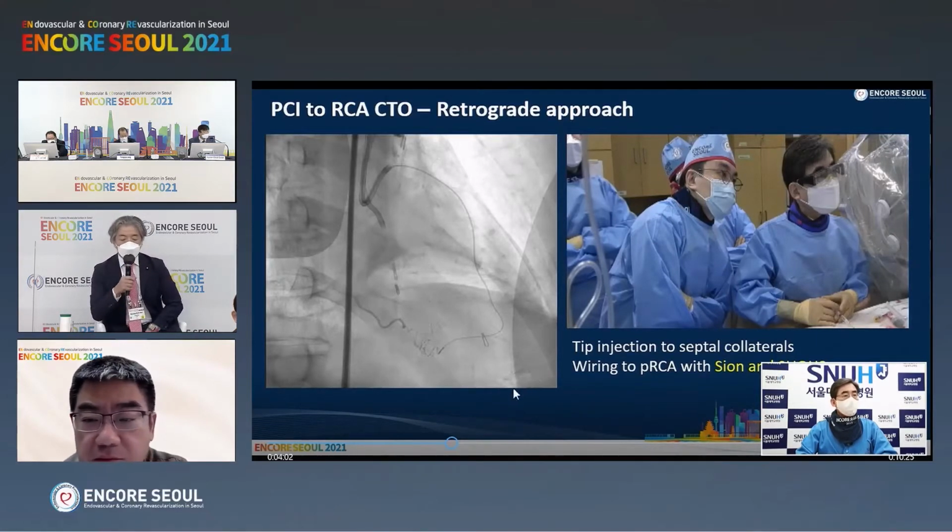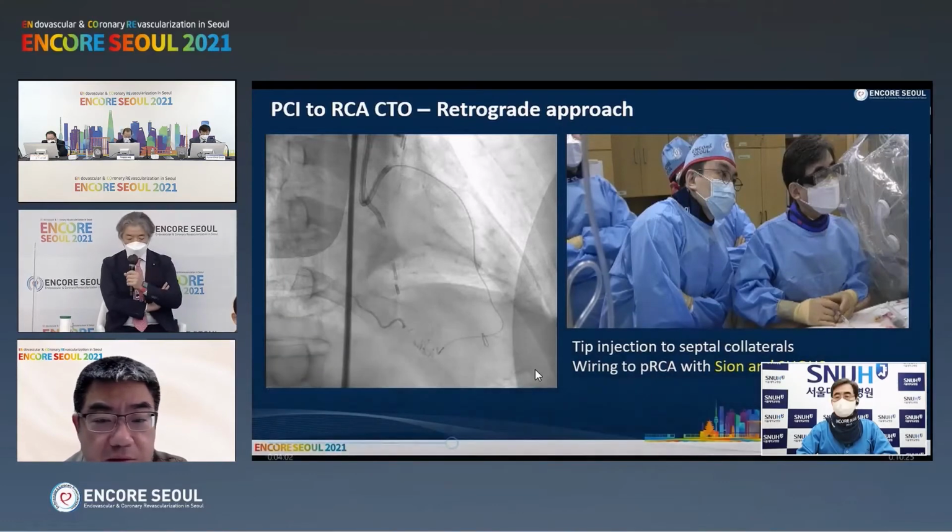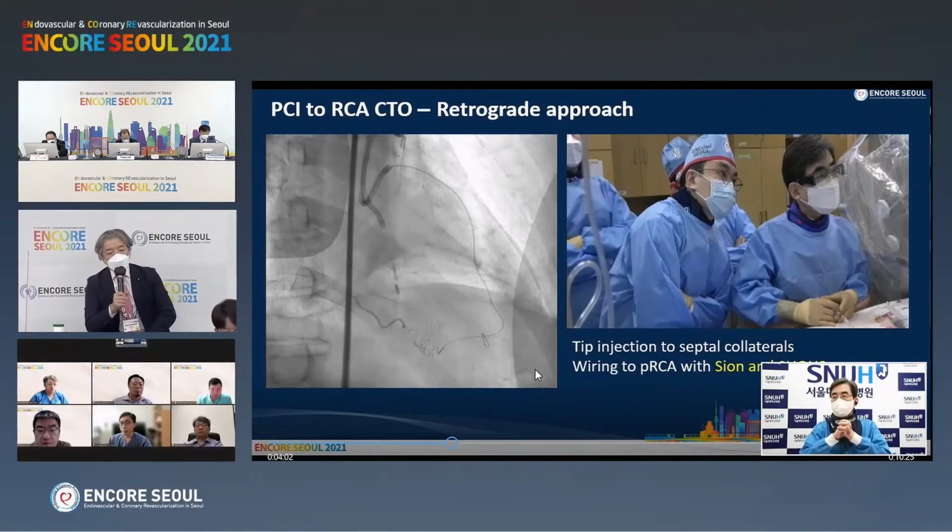Dr. Kim? Okay. I have a question for Professor Hyo-Soo Kim. In case of an RCA ostial CTO, sometimes we need to perform RCA ostial puncture. So I want to know your strategy: do you expect a direct crossing retrogradely, or anyway during the procedure you puncture the proximal RCA ostium? What are your expectations initially?